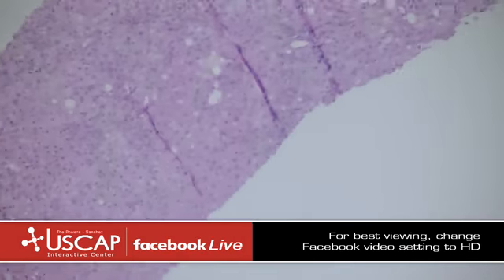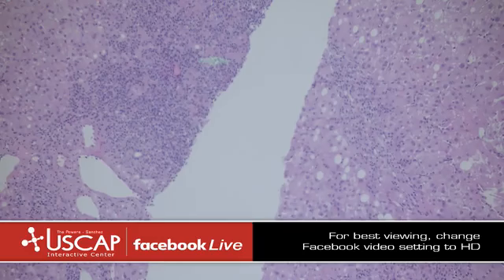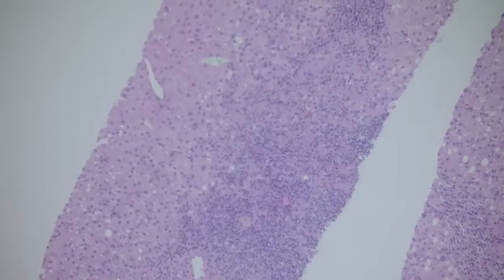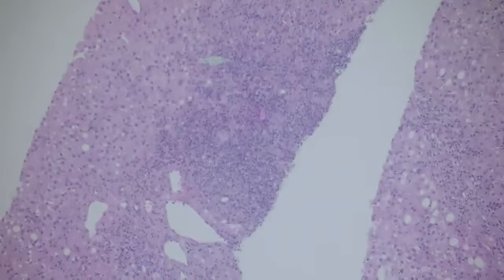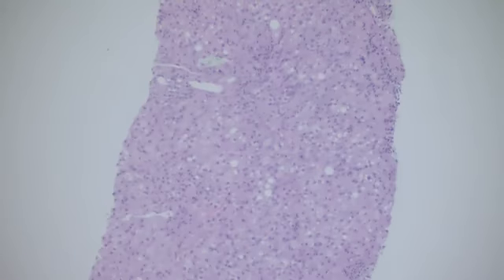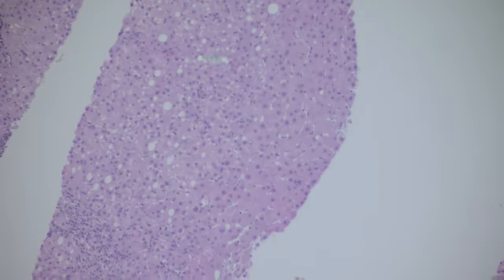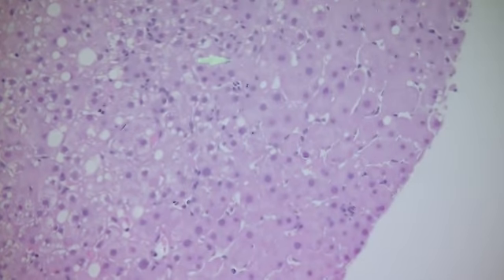Definitely not acute. So chronic hepatitis may be viral, a little bit more activity than you typically see for viral, maybe moderate in this case. It is spilling beyond the interface in a lot of areas. Okay, what's the second thing going on here? Steatosis. Yeah, so steatosis, but more than steatosis, right? So there's lots of fat.